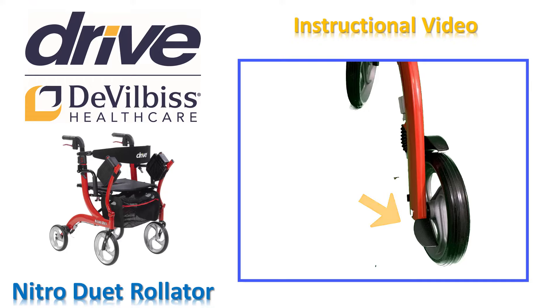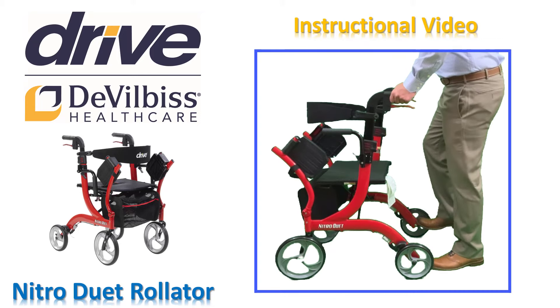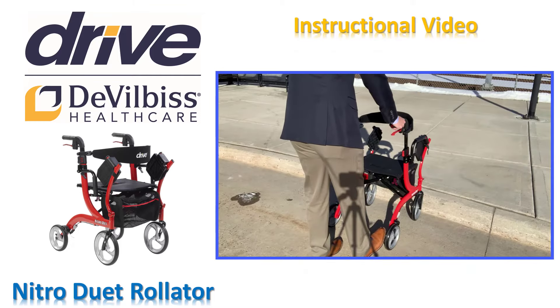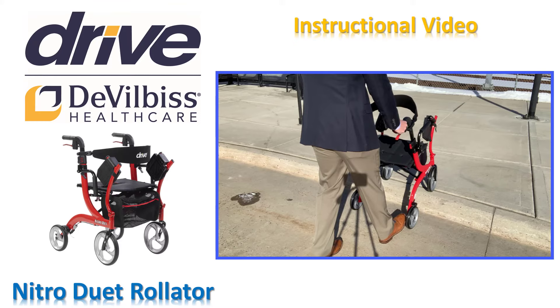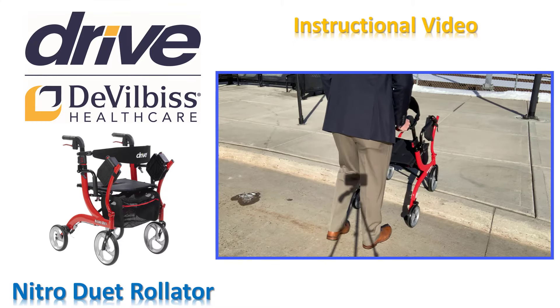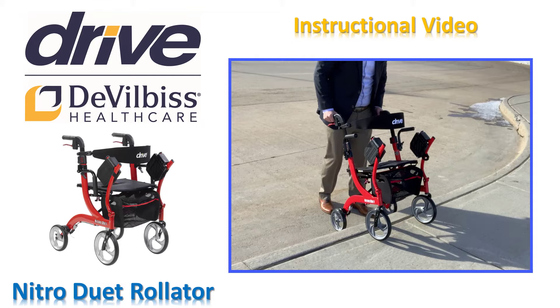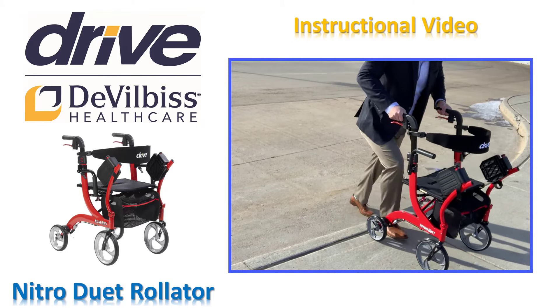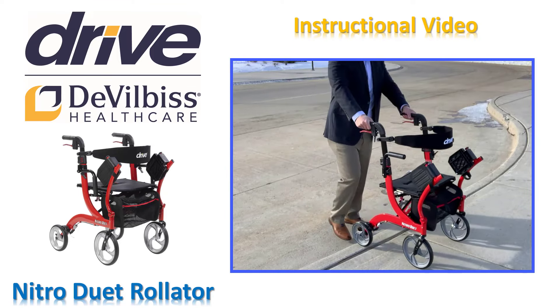It is important to use the curb hopper feature for your safety and to protect your wheels. When approaching a curb, step, or transition, firmly grasp both hand grips and place your right foot on the curb hopper located on the lower right-hand side of the rollator. Use your right foot to activate the curb hopper — do not use your opposite foot. While securely grasping both hand grips, gently apply pressure to the curb hopper with your right foot. Bring the front wheels to a slight angled position just above the curb or step, pushing forward if necessary. Once at a stable position, gently release your foot from the curb hopper allowing the front wheels to rest on the curb, step, or transition. Push the rollator forward as the rear wheels approach, then lift the rear wheels onto the curb and proceed with walking once all four wheels are safely past the curb.